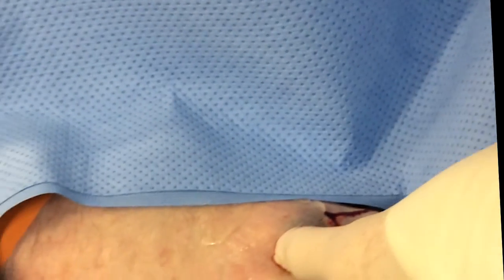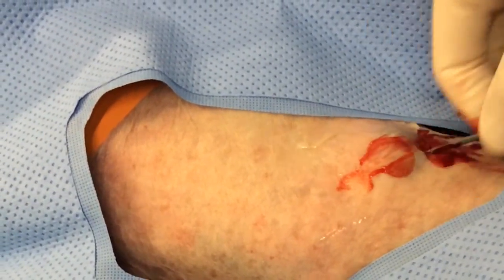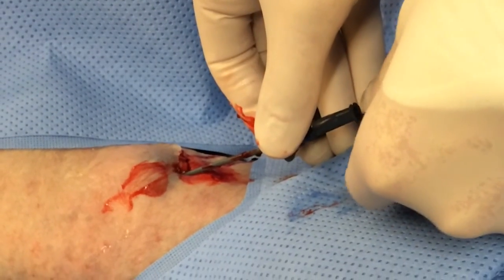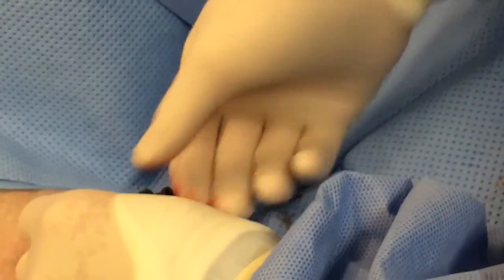He's making a nick over the wire now, and he's going to insert the dilator. Now, the dilator is big and thick, so you really want to make sure it goes easy. And if you're reaching resistance, then rack the wire in and out to make sure it's not still kinked. And when you're actually pushing on the dilator, push right near the skin. Don't push far away by that little T-piece. You want to be a couple centimeters away.